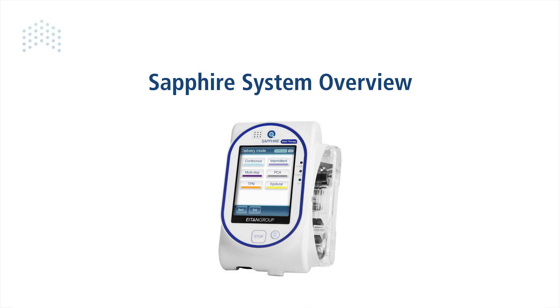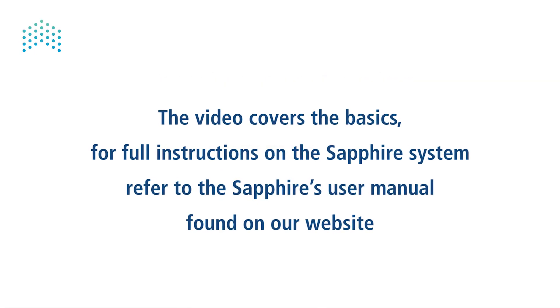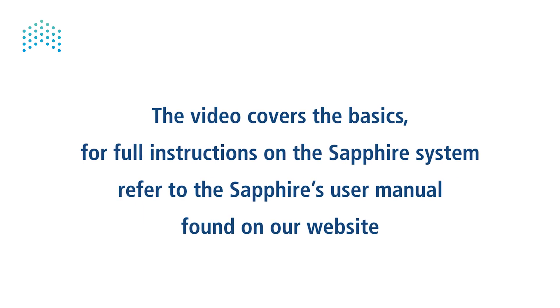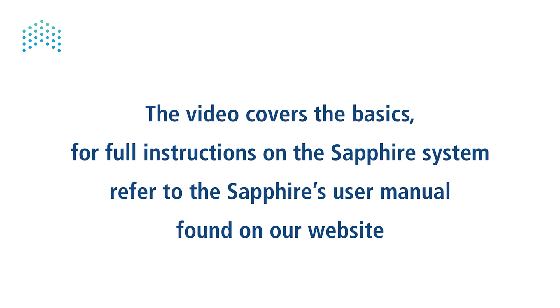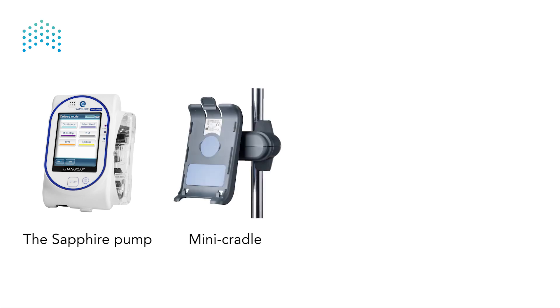Sapphire system overview. This video covers the basics. For full instructions on the sapphire system, refer to the sapphire user manual found on our website. In this video we will review the sapphire infusion system, the sapphire pump, mini cradle, power supply, and administration sets.